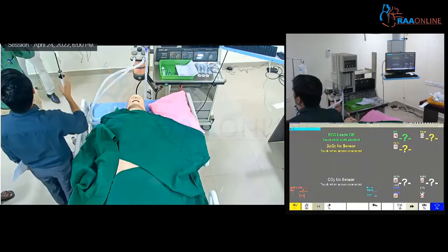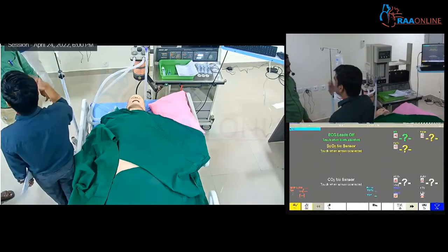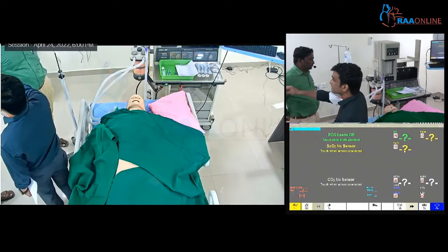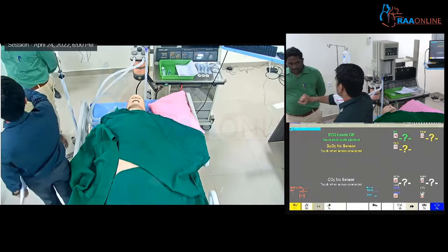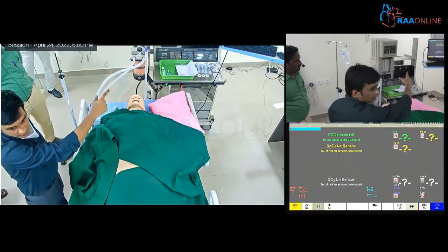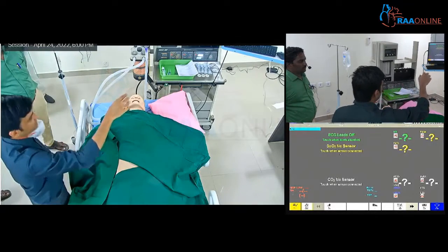Like if you want a monitor to be attached, if you're walking into an OT, usually you would like to attach all the monitors, check the fluids and all those things. Same thing can be done here. So we'll have our technician, Mr. Shiva. He can help you with the monitoring part. You can have the monitors displayed.